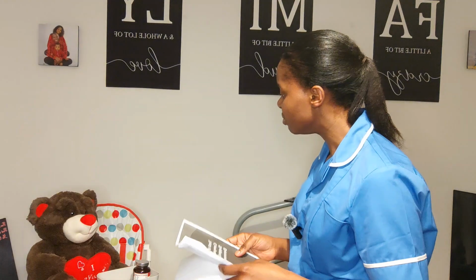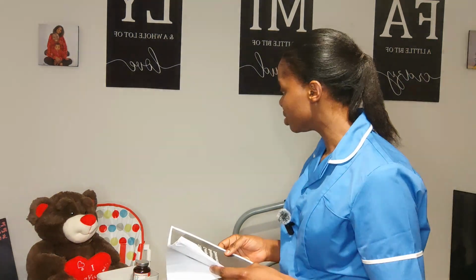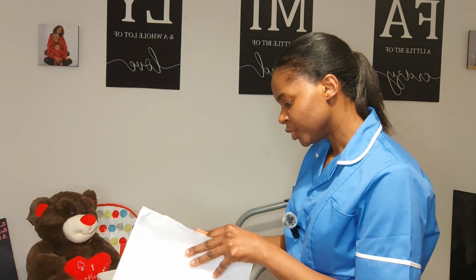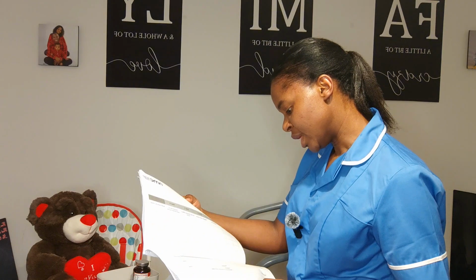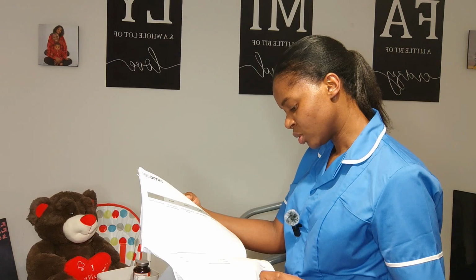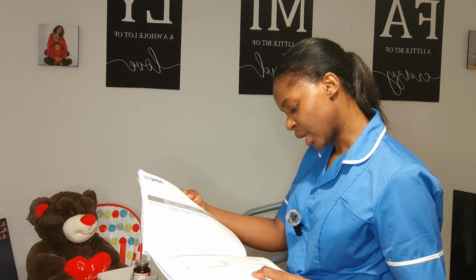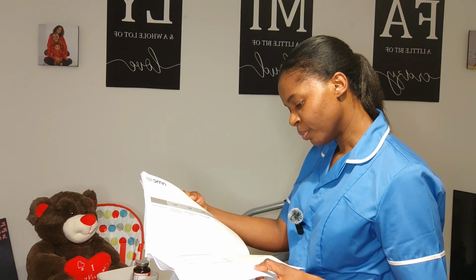Okay, before I step aside to prepare the medication, can I take you through your medication, your home chart, if that is okay by you? All right, thank you very much. So I have the chart for Janet James. The address is 27 Dalton Grove. The date of birth 0101-1992. Your hospital number is 1234567. Okay, and you have no known allergy. The prescriber is Dr. Tolu.